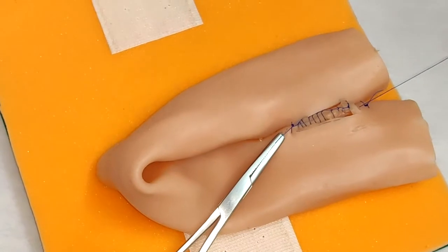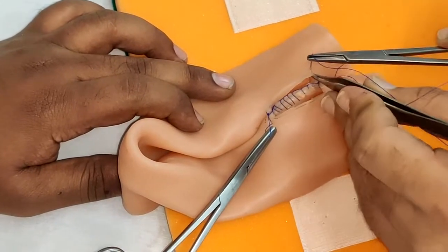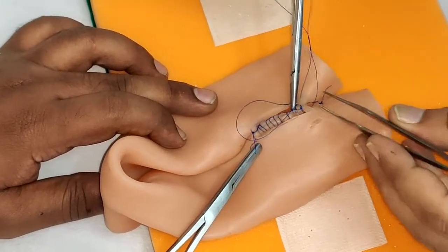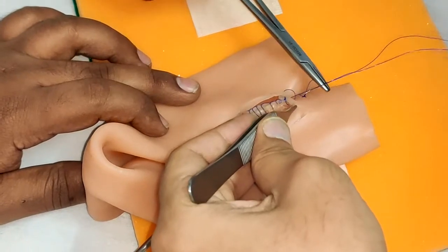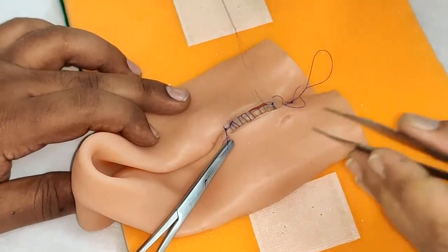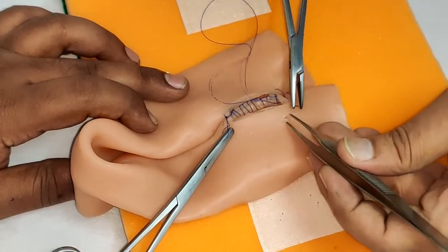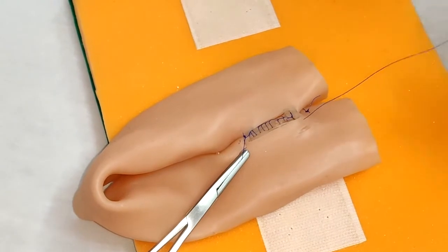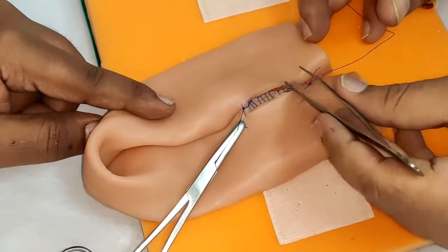Now we will be coming out for the anterior layer. For the corner, we are taking stay sutures and the maneuver is the same: going outside-in followed by inside-out on the same loop, and we will repeat the same on the other loop. The direction of the sutures has to be in line with the bowel so that the angle is not affected.